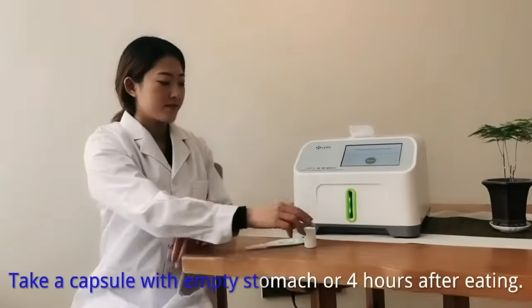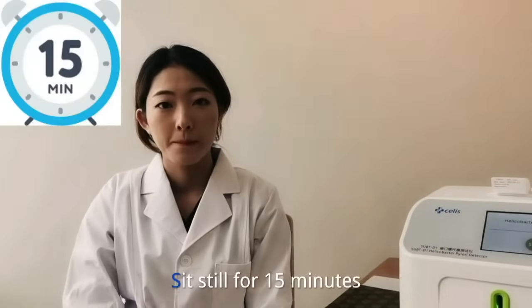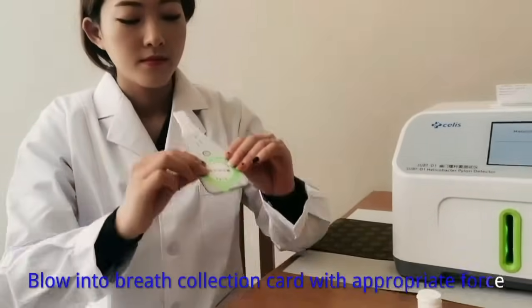Take a capsule with an empty stomach, or four hours after eating. Sit still for 15 minutes. Then blow into the breath collection card with appropriate force.